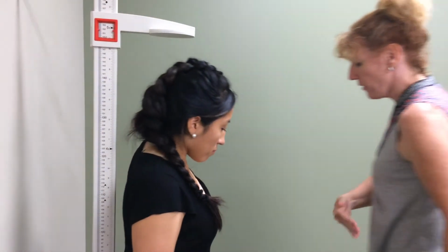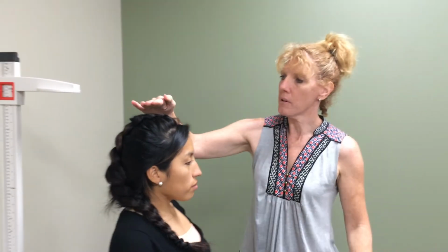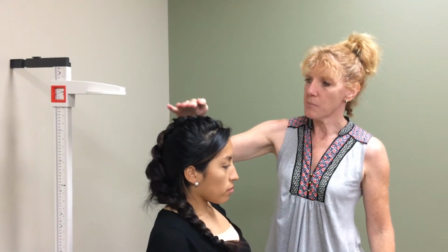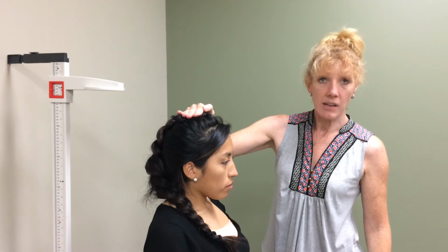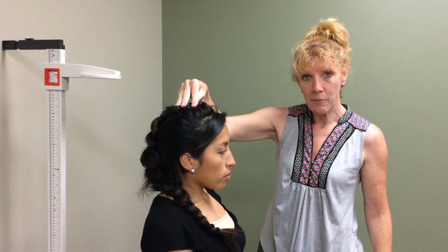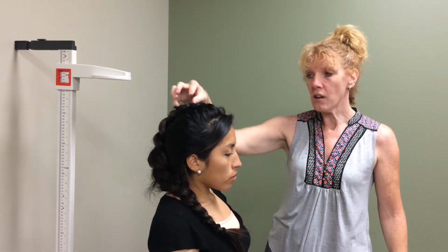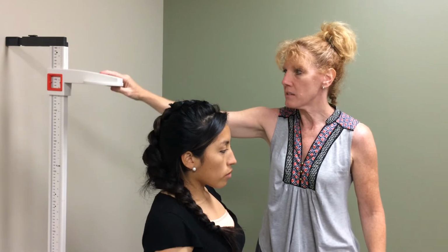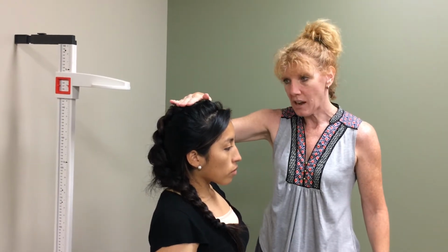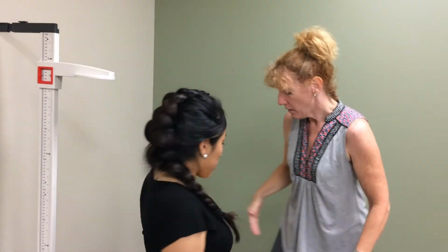Then we have one more thing about hair. Fanny has a braid, but I can compress it to get to her actual height. If she had a ponytail or something else on top of her head, you may have to either remove the ponytail or move whatever was blocking this to get down to the actual top of the head as opposed to the top of the hair decoration.